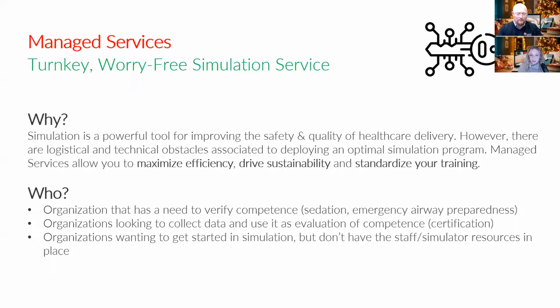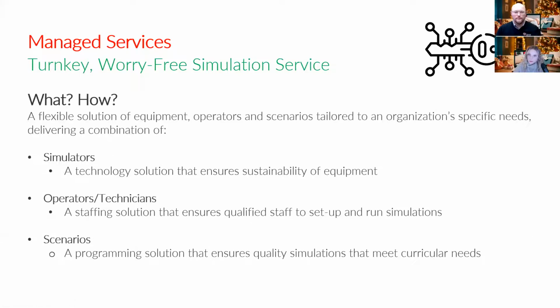Organizations are looking to collect data on these simulations and evaluate that competence to then deliver certifications to their clinicians, or even organizations that are really just wanting to get started in simulation but don't necessarily have the staff, the fleet of simulators, or just the resources to handle high turnover, new technicians coming in. So this is a really great solution for that.